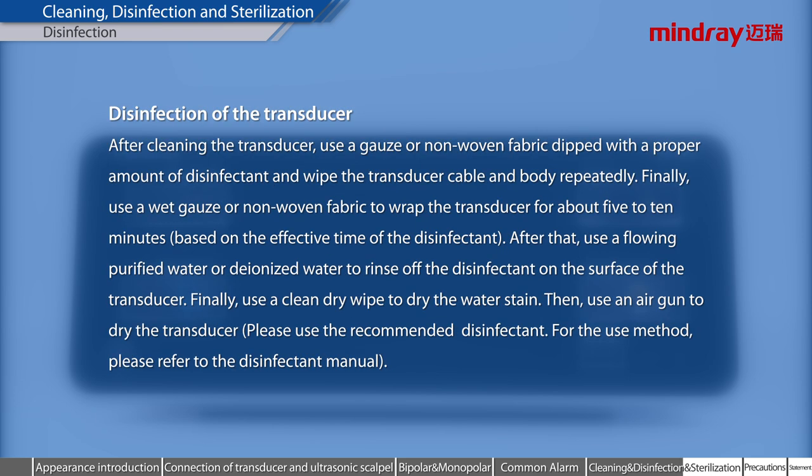Disinfection of the transducer. After cleaning the transducer, use a gauze or non-woven fabric dipped with a proper amount of disinfectant and wipe the transducer cable and body repeatedly. Finally, use a wet gauze or non-woven fabric to wrap the transducer for about 5 to 10 minutes, based on the effective time of the disinfectant. After that, use flowing purified water or de-ionized water to rinse off the disinfectant on the surface of the transducer. Finally, use a clean dry wipe to dry the water stain, then use an air gun to dry the transducer.